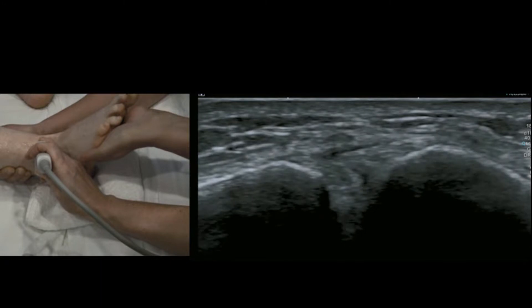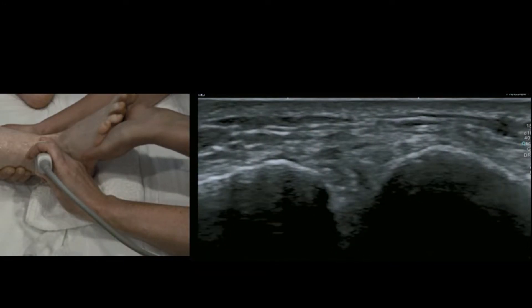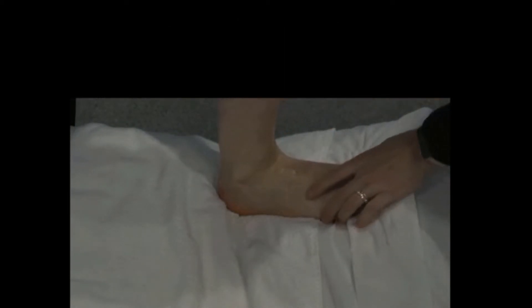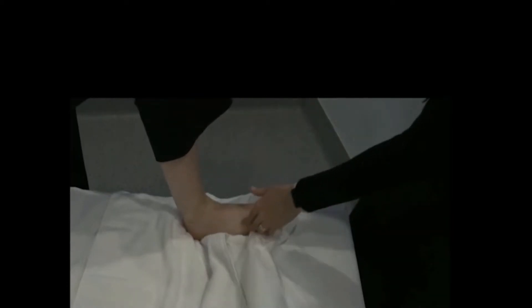So we're simulating weight bearing. It's a luxury if you have an assistant or a physio to do this for you. If you don't, you can do it without an assistant. If you're a ballet dancer, you can go into demi-plié position and get them to go from squat to stand. Or you can put a roll under the forefoot to dorsiflex, or tilt the floor of your bed up, or rotate the foot out and ask them to weight bear on and off the foot.